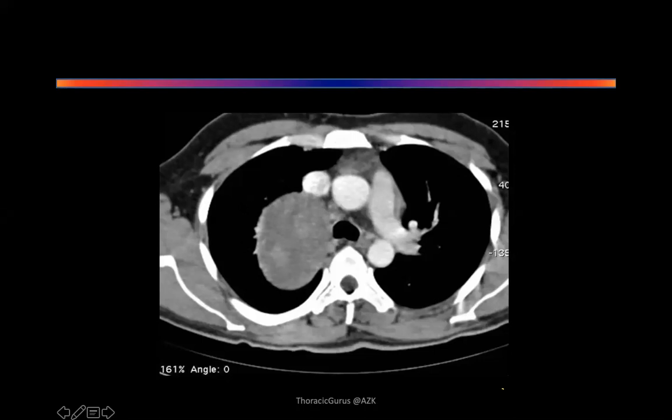Diagnosis quickly. Bronchogenic cyst. Yeah, good. I'm happy with that. Simple. It's very simple. My first diagnosis probably is a bronchogenic cyst. Any other cysts you want to call it? Sir, since it cannot be differentiated from the pericardium very well, it could be a pericardial cyst. We don't know that because we haven't seen the up and down images, okay? So it could be more than one thing.